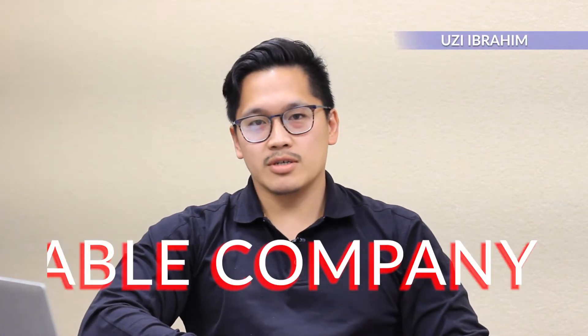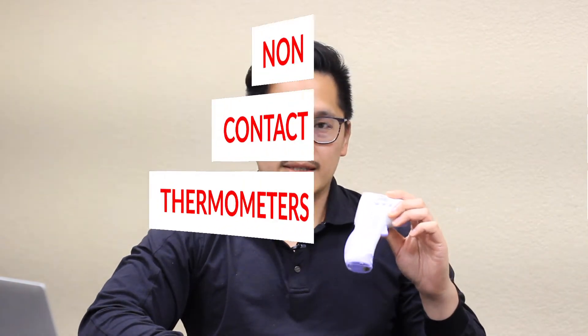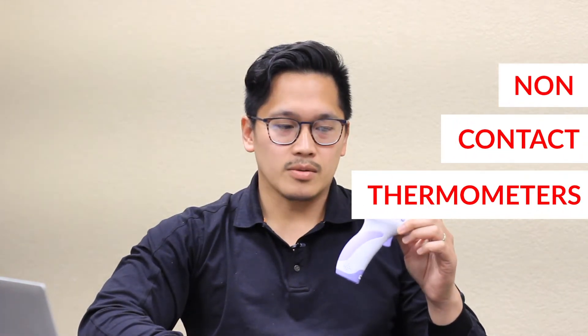Hey everyone, this is Uzi with Able Company Ventures. We help companies around the globe with implementing fever screening procedures using things like this. So today, I wanted to talk to you about non-contact thermometers. When it comes to fever screening in public places or even places of business, the most common thing you're going to see are these non-contact thermometers, or maybe colloquially known as a temp gun. There are a lot of good things about the temp gun, but there are a lot of bad things that come with it too.